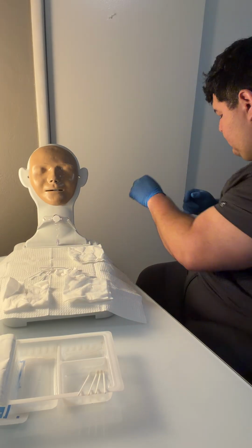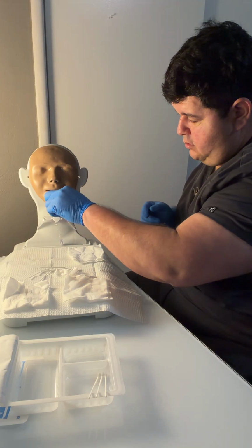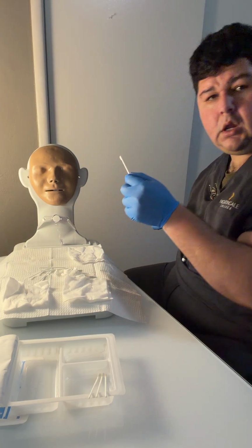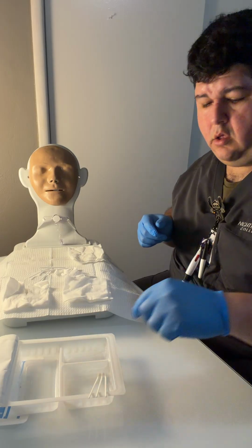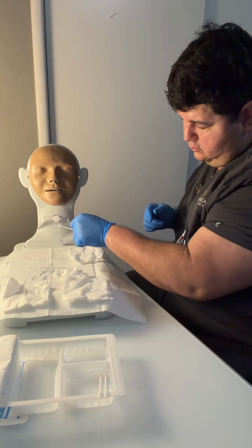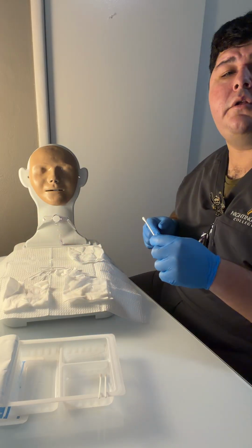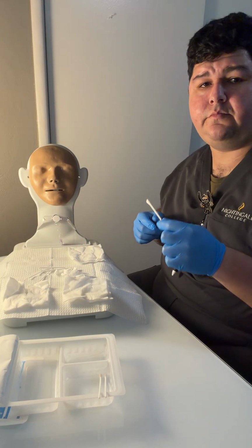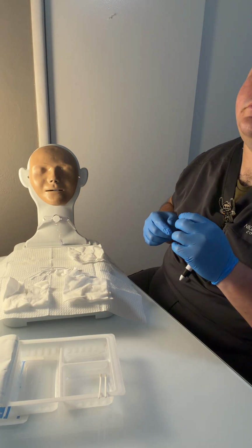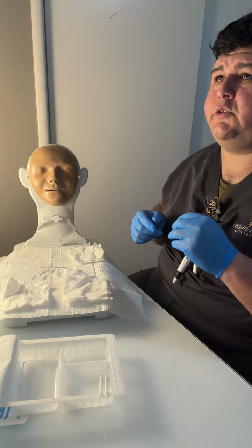Then we're going to discard that. I'll take another one and clean the faceplate. Discard that. Then we're going to clean around the trach. We want to clean around the trach and get all the excess off the flange. I'm going to discard that. If I need to, I can take gauze and do some pat dry.